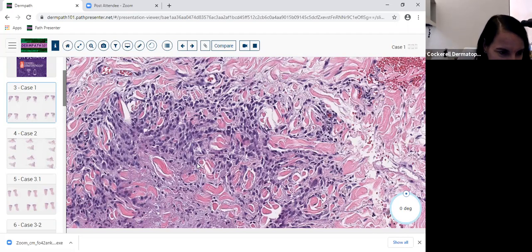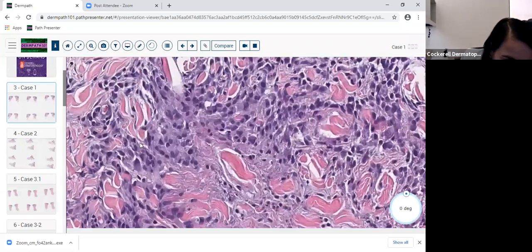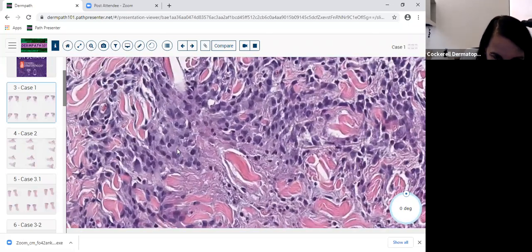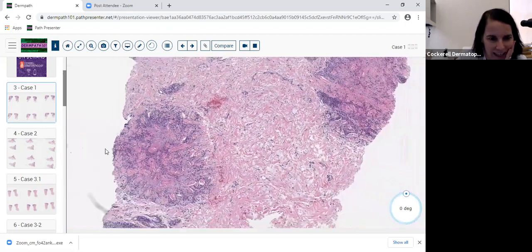So what we're seeing here are some beautiful histiocytes, and they're not epithelioid. You don't see cytoplasmic membranes, but if these cells were epithelioid, you might want to think about an epithelioid sarcoma. They would have high NC ratios, lots of mitotic figures, and very much high grade cytologic atypia. So you might think about epithelioid sarcoma in the differential, but not on this slide, absolutely not. This looks very much benign.